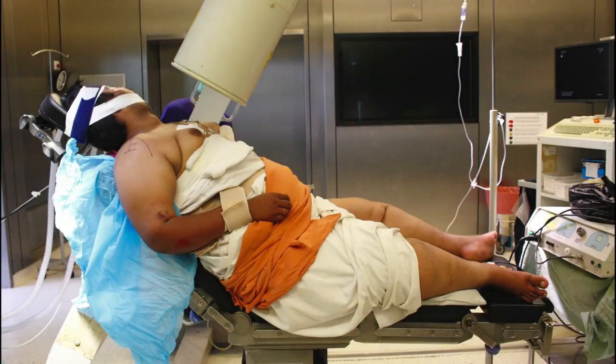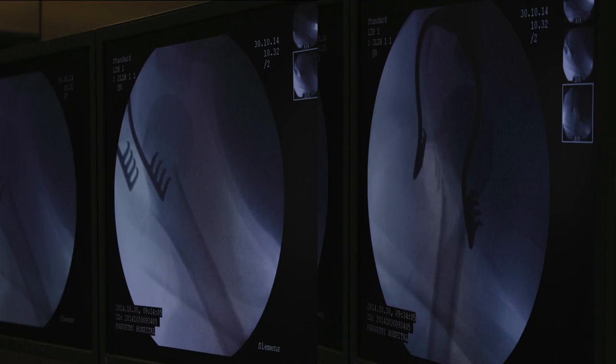The strap incision to perform an extended deltoid split approach is especially useful in an obese patient. The patient is placed in a beach chair position with the image intensifier from the opposite side, allowing the surgeon to take a true AP and a modified axial view of the shoulder. This obese patient has a two-part surgical neck fracture displaced into varus.